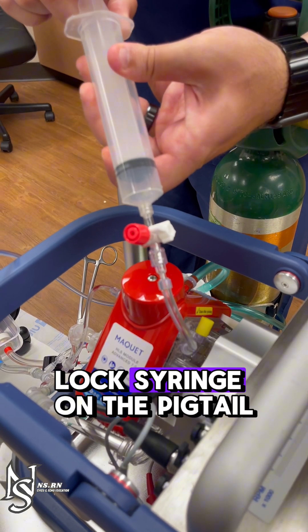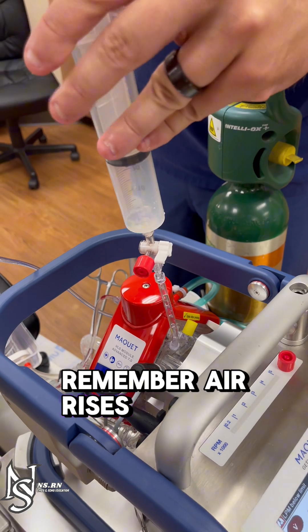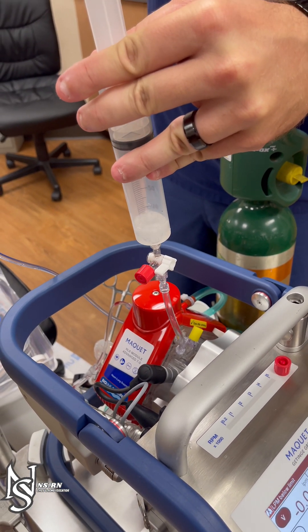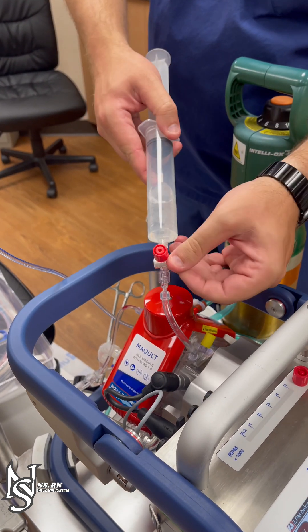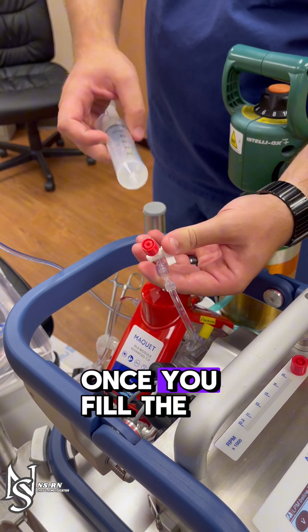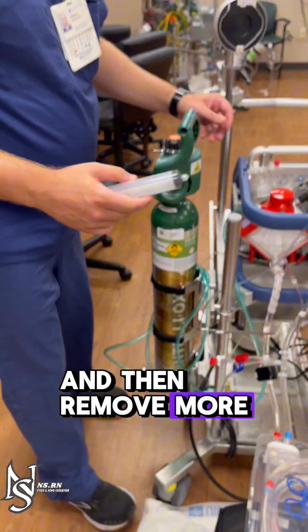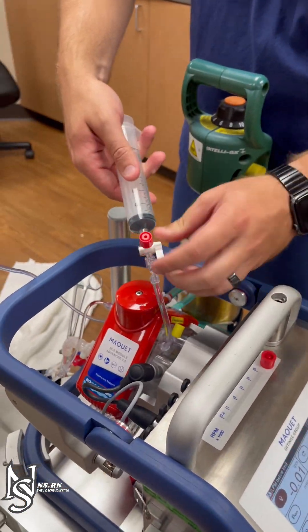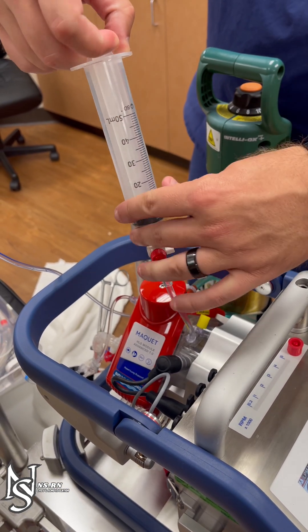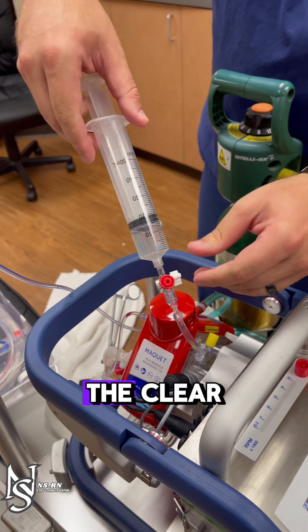Use a 50ml Luerlock syringe on the pigtail to pull back and remove air. Remember, air rises. Once you fill the syringe, quickly squirt the blood and air on the ground, then remove more air if needed. When you are only getting blood, you should be in the clear.